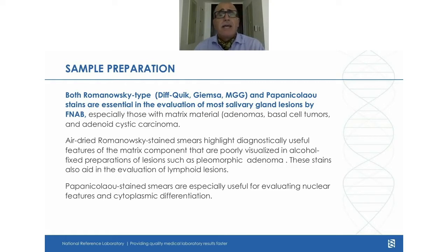The air-dried Romanowsky stained are very good for matrix components, so collagen, basal membrane, mucin, etc.